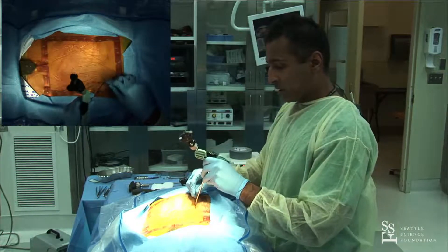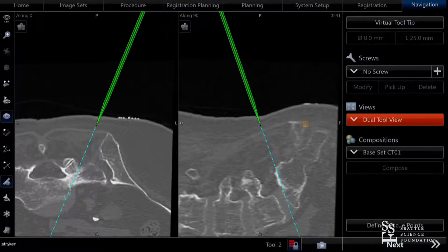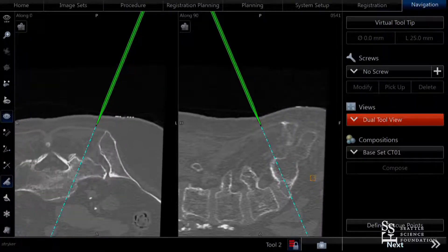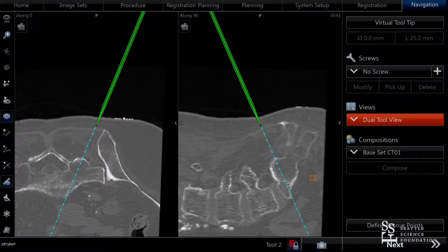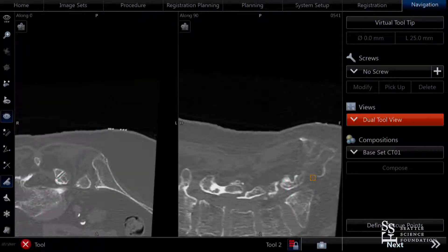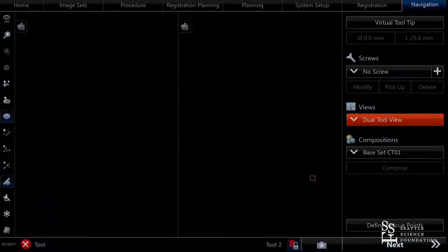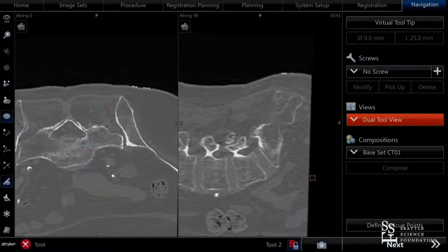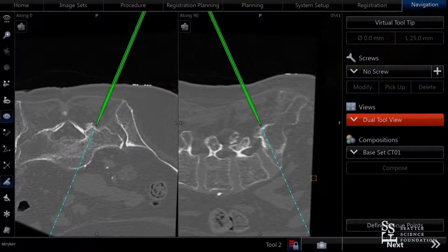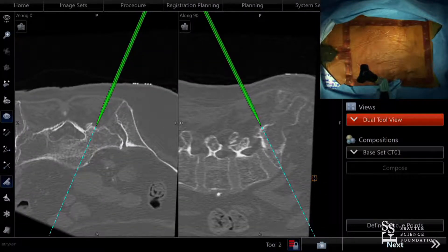I'm going to pre-plan where my incision is going to be. I put the Jamshidi directly over the target area — this doesn't have to be a perfect angle since I'm just planning my entry point. For S1, that looks reasonable, so I'll mark there, make a stab opening, then enter with the Jamshidi. Just like a fluoro-based screw, we find our starting point on navigation.